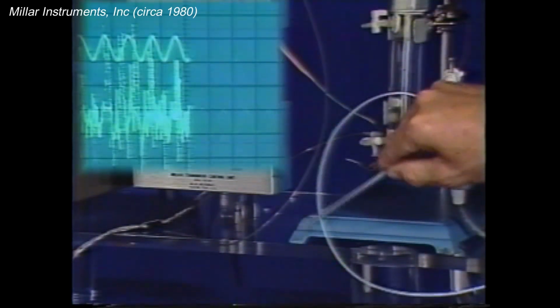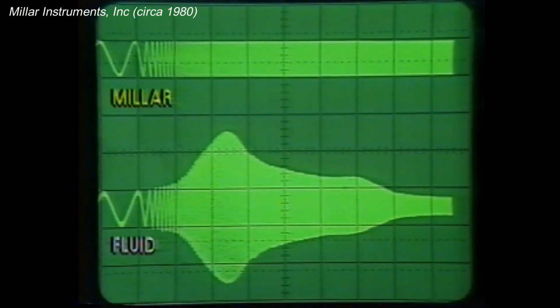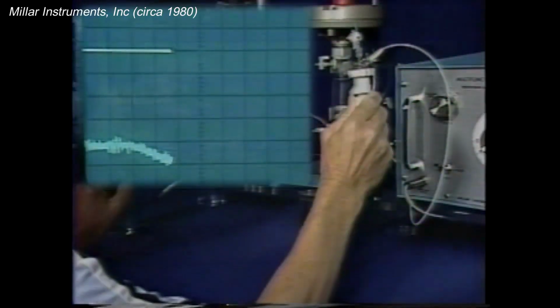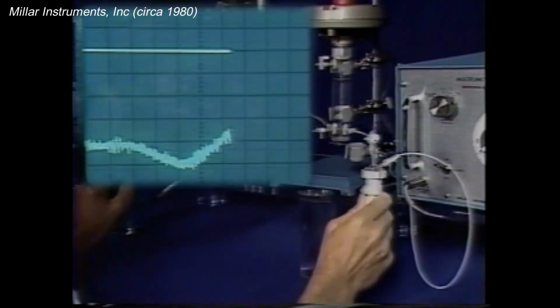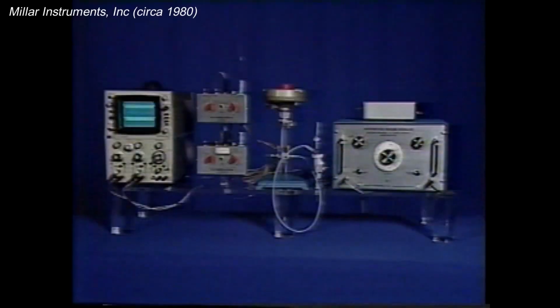What you will see in this demonstration is that all of these undesirable characteristics of fluid-filled systems and the resultant inaccurate information can be eliminated with Millar catheter-tip pressure transducers. Since the Millar catheter-tip pressure transducer measures pressure at the source and does not require fluid as the means of signal transmission, the accuracy of the pressure signals is assured. This demonstration illustrates the difference in recording capabilities using a Millar catheter-tip pressure transducer and a conventional fluid-filled catheter with an external transducer. Let's first look at the components of our setup.